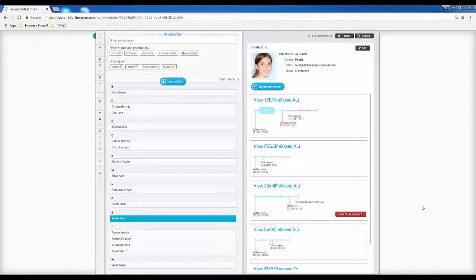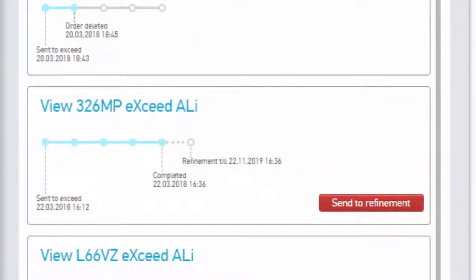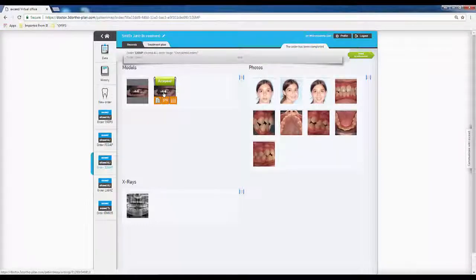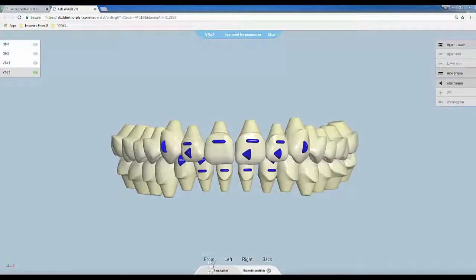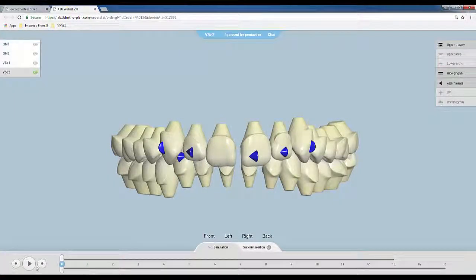Order progress can always be tracked using the Progress bar. Within a few days, the Exceed plan shall become available for review and approval.